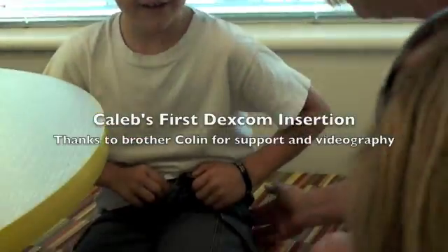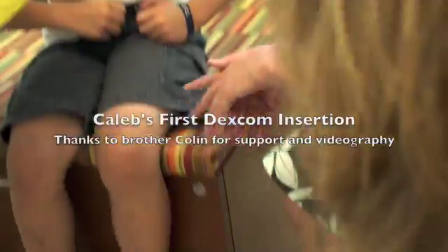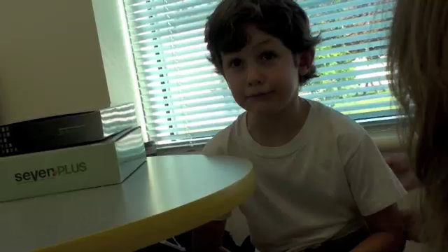We're going to do it while you're sitting, because that way I'll make sure I don't put it in a spot that you're going to sit on. You're okay with that? Yes. Okay, so let me just look, okay?